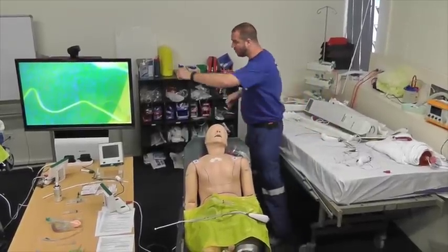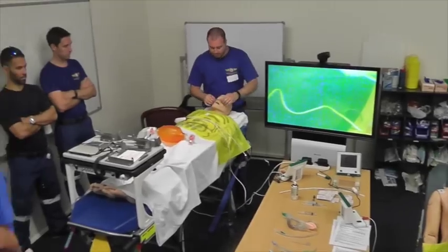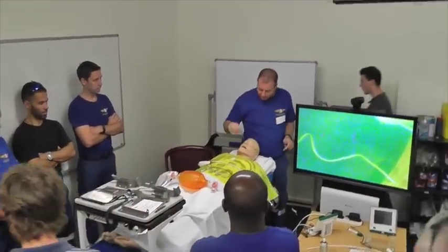Okay. We're going to move over here. You can come a little bit closer. We're going to see the stuff on the screen. I put my nasopharyngeal in. If I've got lignocaine gel, I put it on the outside and I put it in.